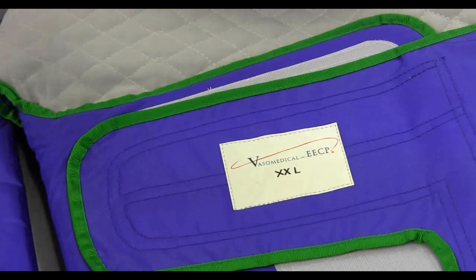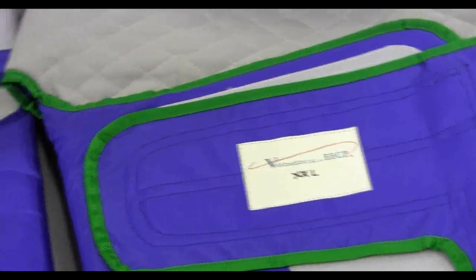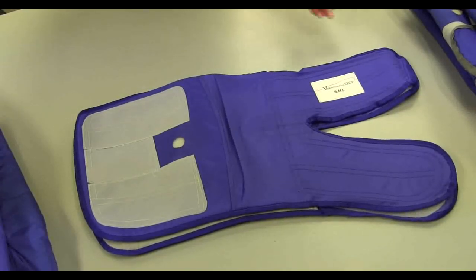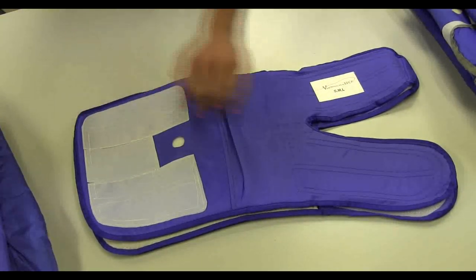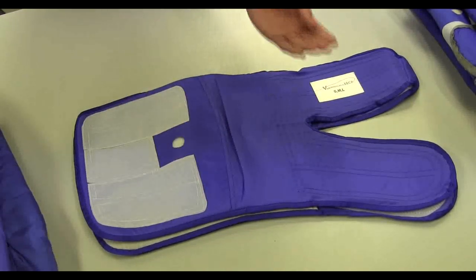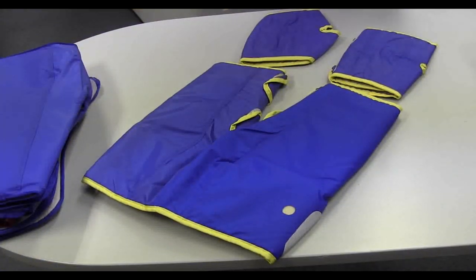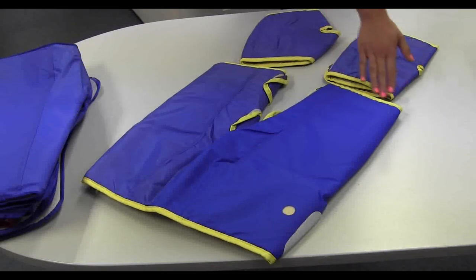Cuff sizes are also indicated on the outside of the cuffs. The blue trimmed calf cuffs are used with the small, medium, and large upper thigh cuffs. Extra small and extra large calf cuffs are piped in corresponding colors.